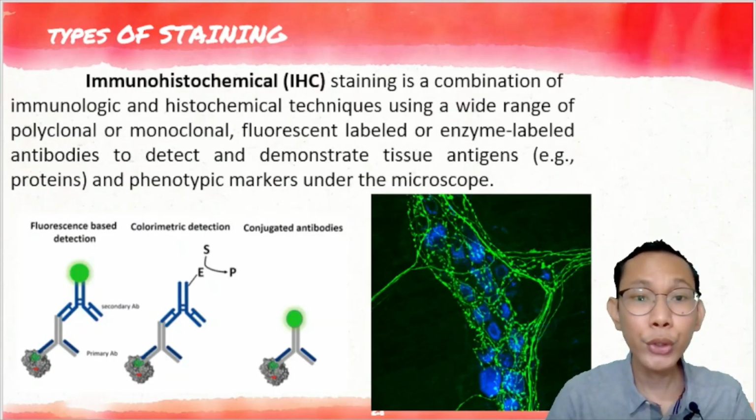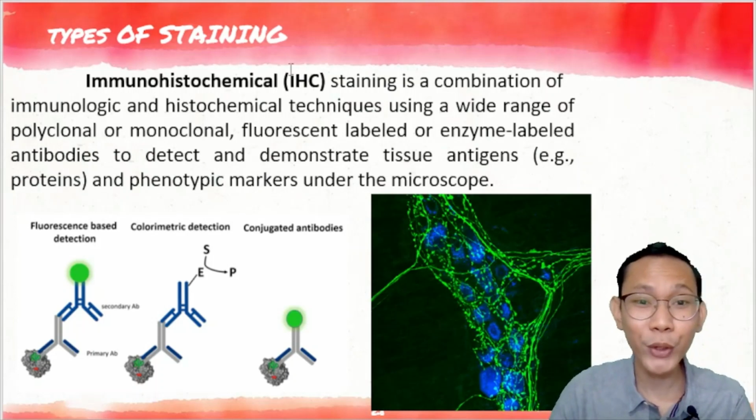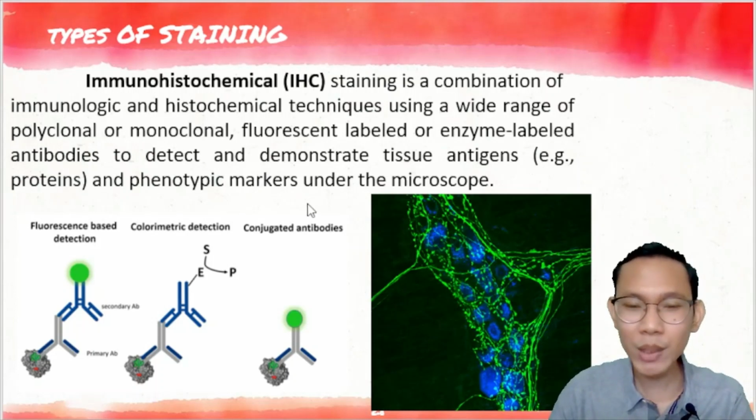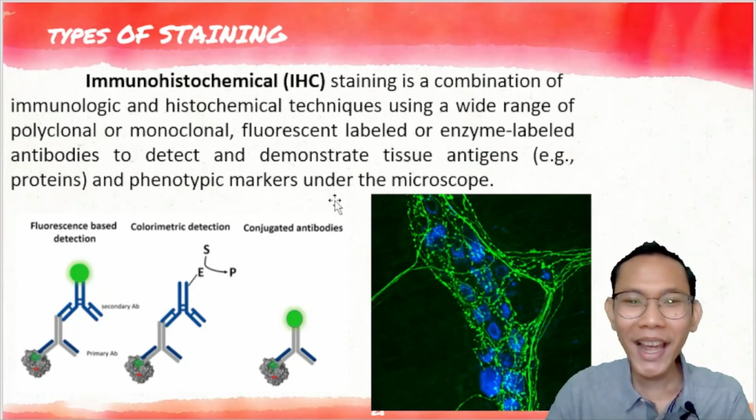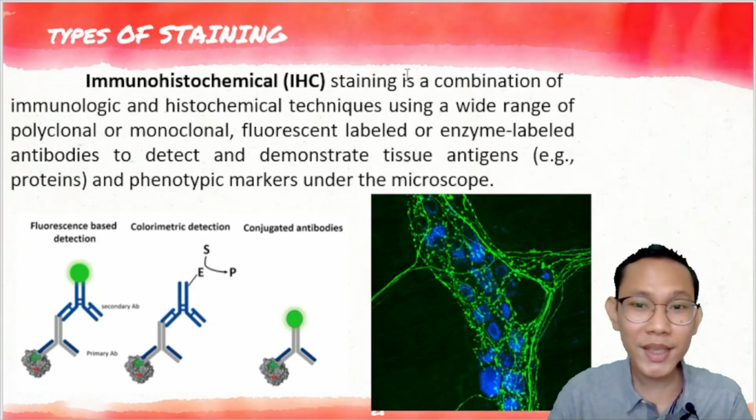We have also your immunohistochemical staining. So you have a separate topic also for your IHC staining. I guess this will be discussed by Dr. Charlie. Makikinig nga ako dito kasi I never had the chance or opportunity to see IHC staining. Personally, wala talaga, never pa ako naka-encounter or nakakita under the microscope. So IHC staining is a combination of your immunologic and histochemical techniques.